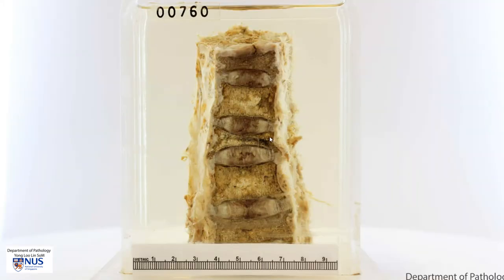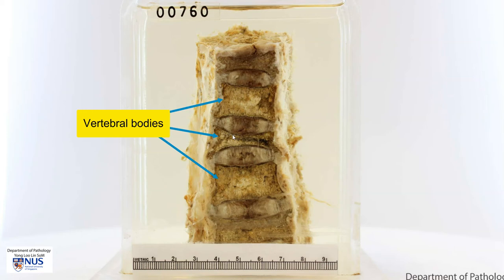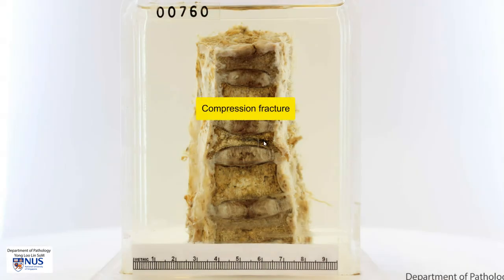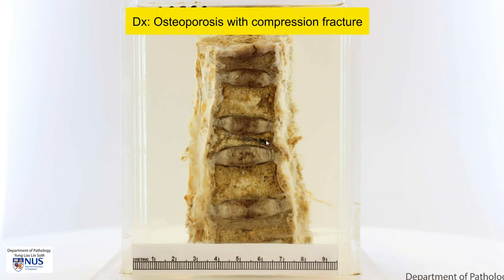If we look closely, we can see that the most obvious abnormality is that the vertebral bodies are of differing heights. In particular, this vertebral body has a biconcave shape and it is markedly compressed compared to the adjacent vertebral bodies. We can also just about make out a fracture line here horizontally, so there is a compression fracture of this vertebral body. The bony trabeculae also appear a little bit more spongy than usual. The diagnosis here is osteoporosis with compression fracture.